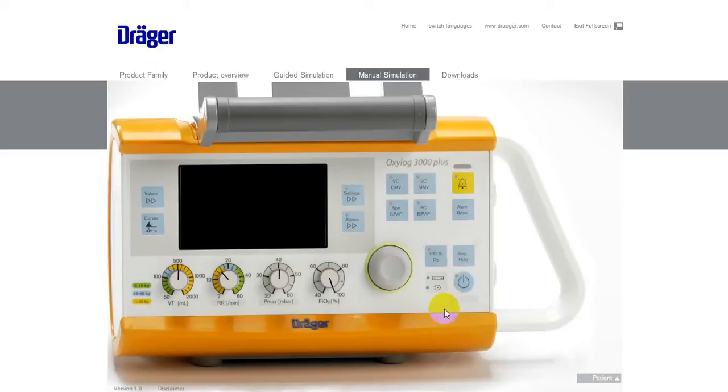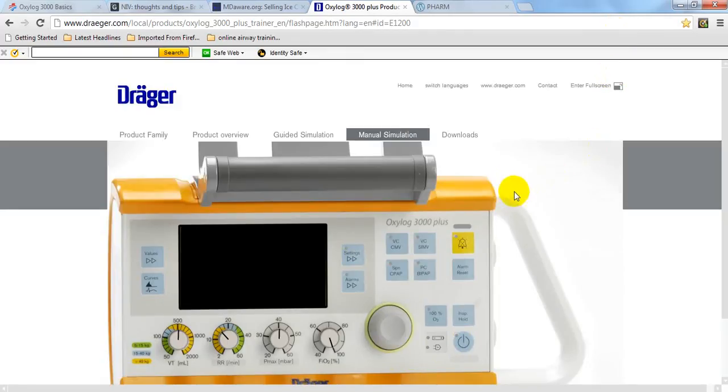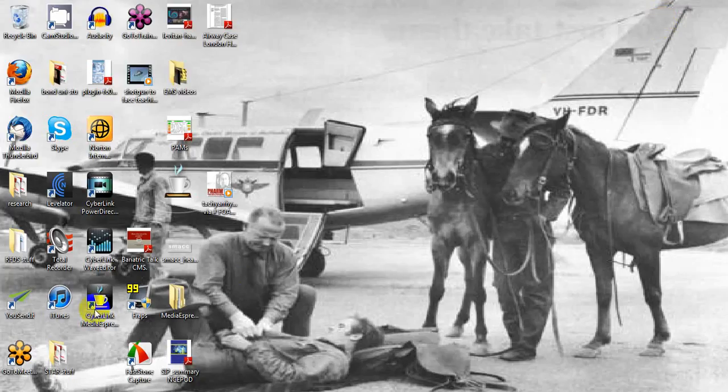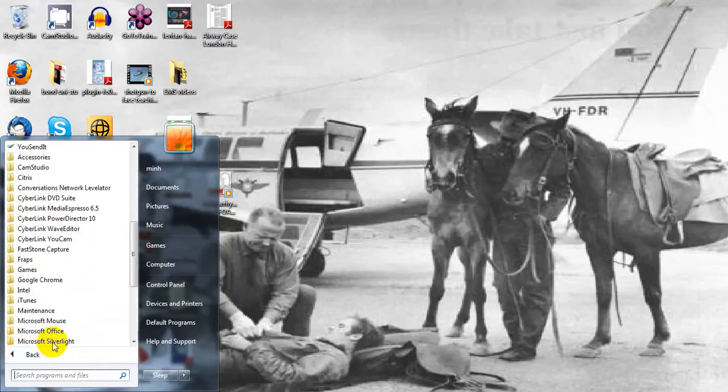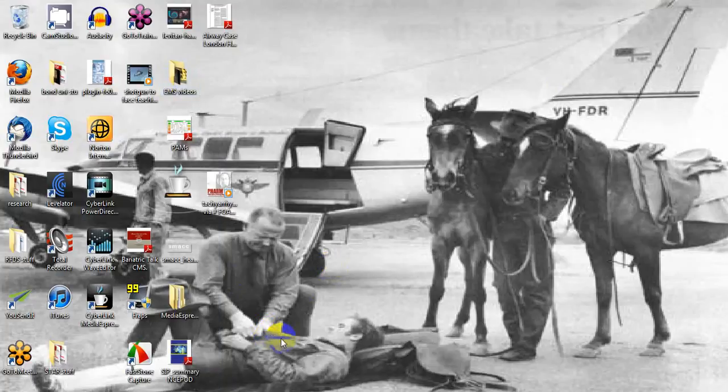Once you finish, turn the device off. That's it folks — I hope you found that useful. Give us your feedback, and Andy, I hope to hear that you have a successful first use of the Oxilog 3000 with non-invasive ventilation. Thanks guys.